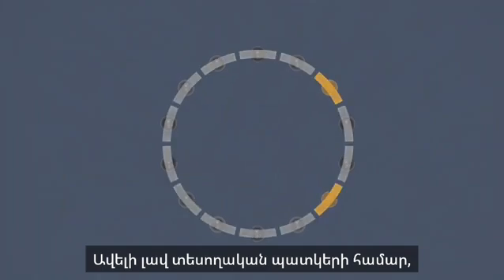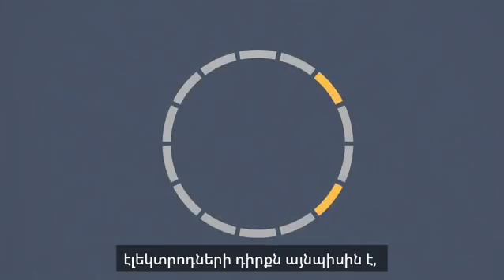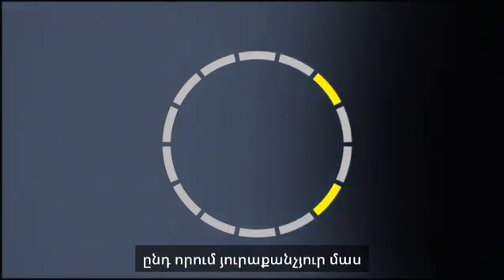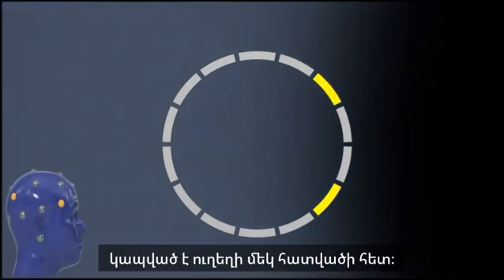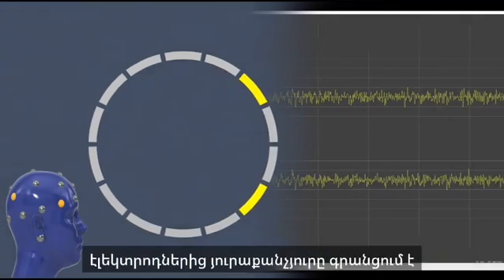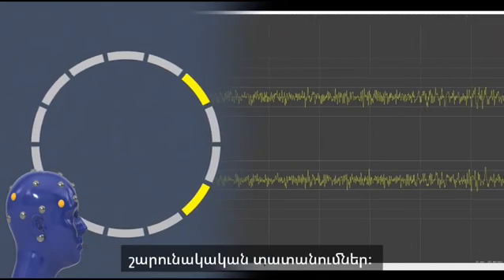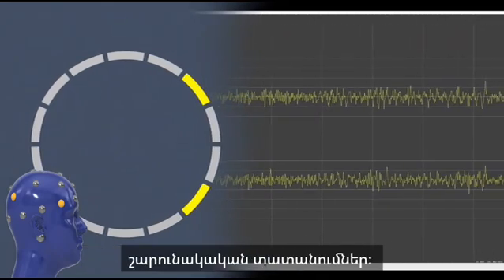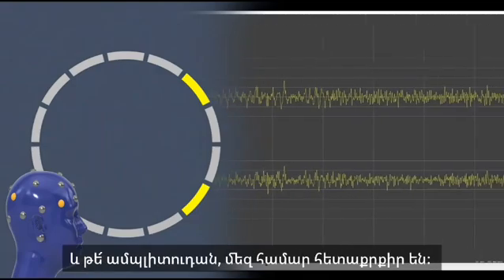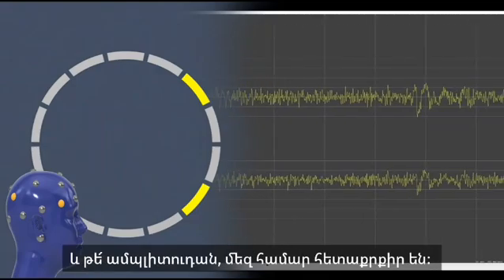For a better visualization, the electrode positions have been rearranged into a circle, each segment corresponding to an area of the brain. If we consider these two positions, each electrode records a continuously fluctuating graph. Both the frequency and the amplitude of the graphs are of interest to us.